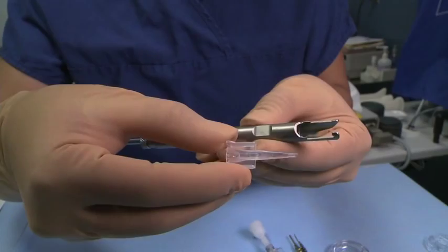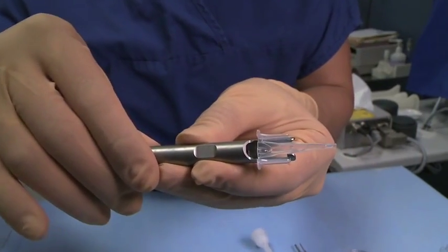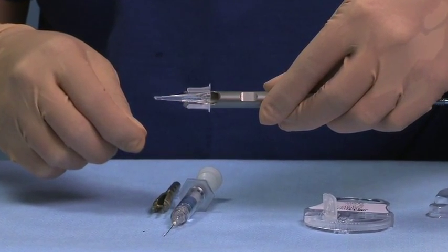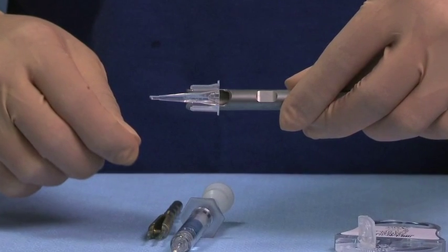Insert the cartridge bevel tip so that it slides into the handpiece cartridge slots. Push down firmly on the back end of the cartridge to securely snap into the handpiece. If the rod tip makes contact with the cartridge, the cartridge has not been inserted correctly. Retract the rod and ensure that the cartridge is fully snapped into the handpiece before moving forward.